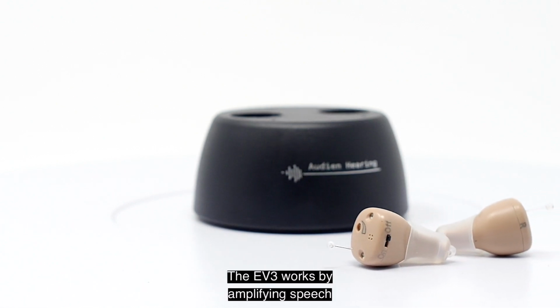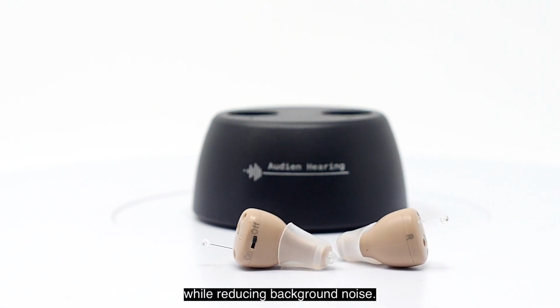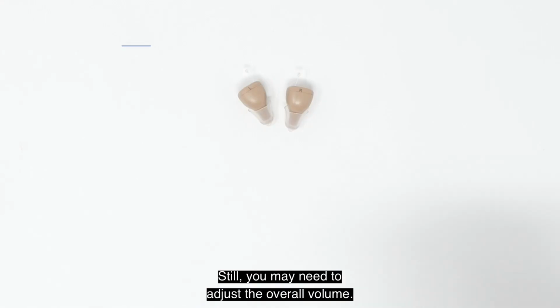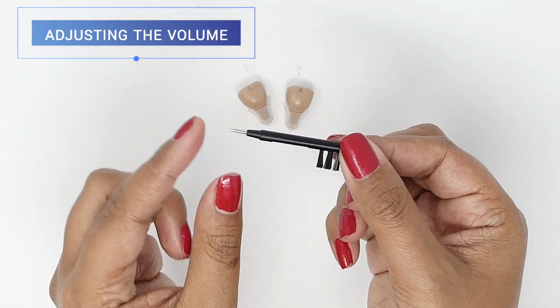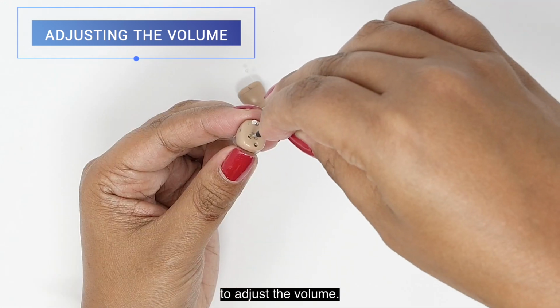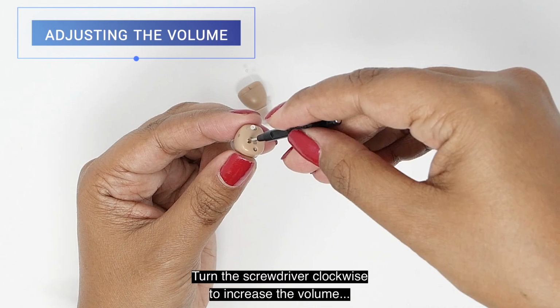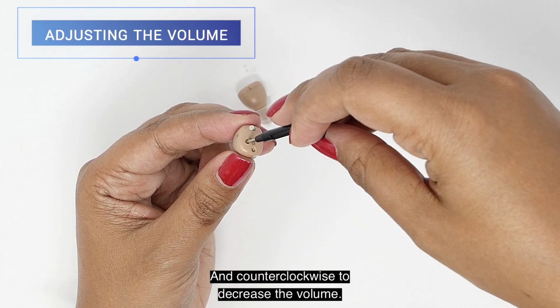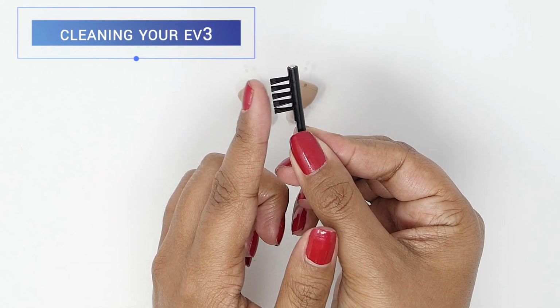The EV3 works by amplifying speech while reducing background noise. Still, you may need to adjust the overall volume. Simply use the small screwdriver that came with the EV3 to adjust the volume. Turn the screwdriver clockwise to increase the volume and counterclockwise to decrease the volume.